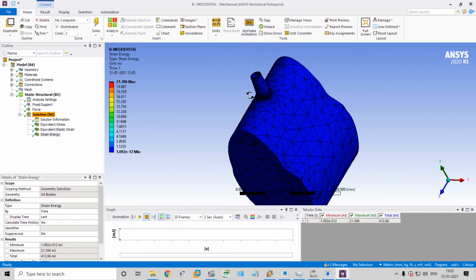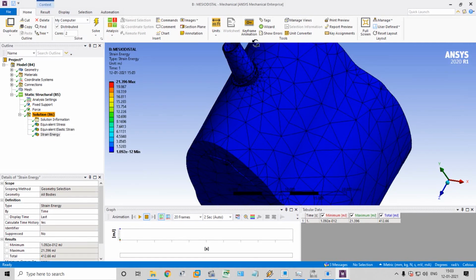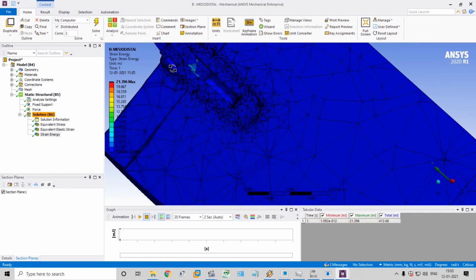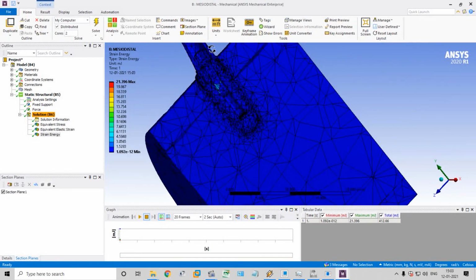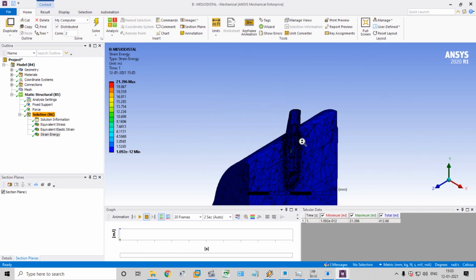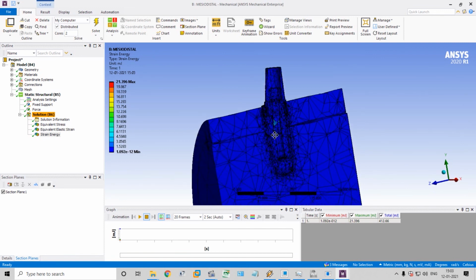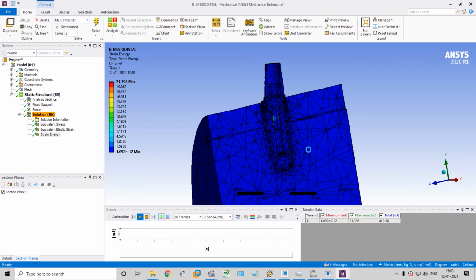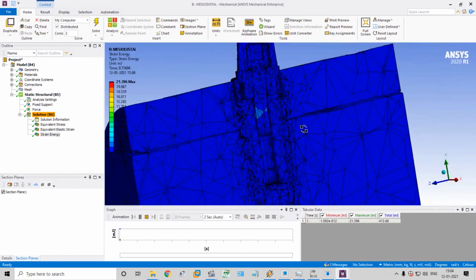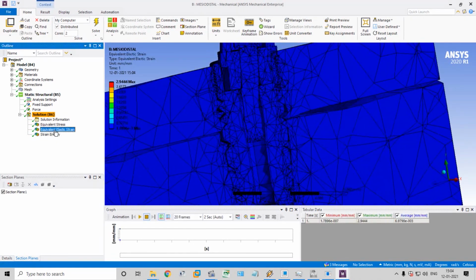Okay, the mesiodistal load was solved. You can see the result here. This is a half plane. Okay, playing the animation. You can see the stress formation in the bone, movement of the bone, especially cancellous bone, and strain formation and stress in the abutment screw.